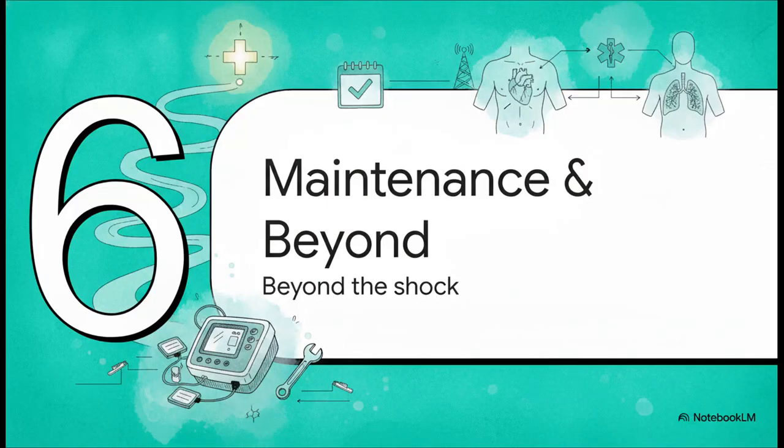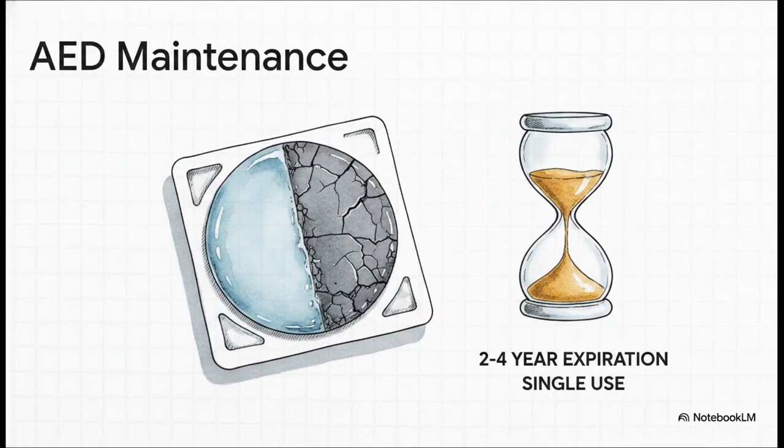Finally, Section 6, Maintenance and Advanced Support. We're nearing the end of the rescue journey here. Just having an AED on the wall is really only half the battle. It's got to be properly maintained and understood within the broader context of emergency medical care. So there are some pretty strict maintenance rules you really need to know.